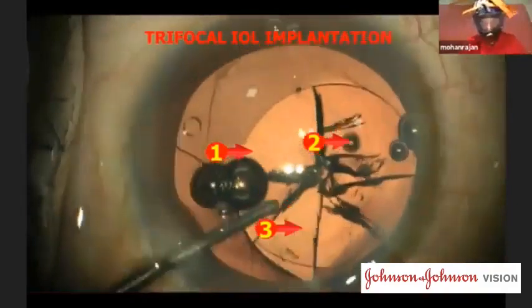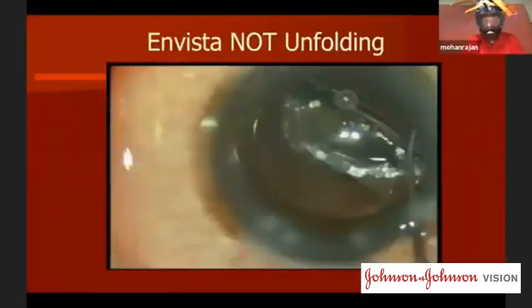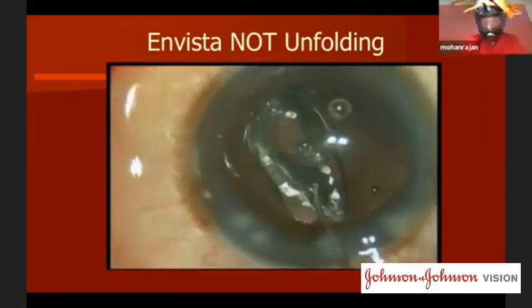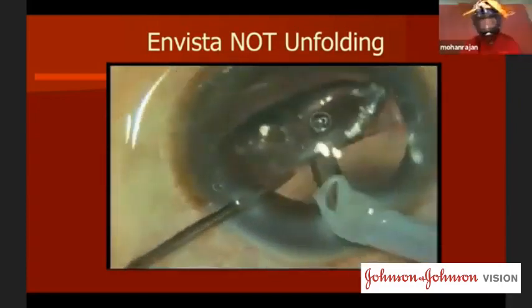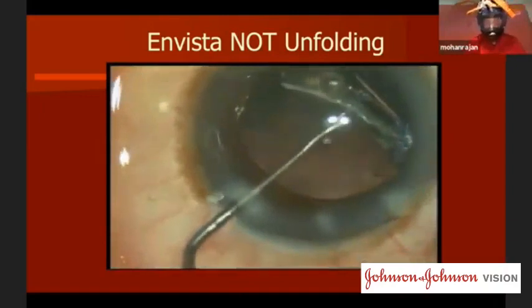This is, as you know, the Envista lens, which doesn't unfold. Suppose you put the Envista lens today, it will unfold tomorrow, but this lens never unfolded at all. You can see this acrobatics in the anterior chamber. I am waiting for 3 minutes, 5 minutes, 8 minutes. Then obviously we have to explant this lens, and this Envista lens never unfolded in the eye.